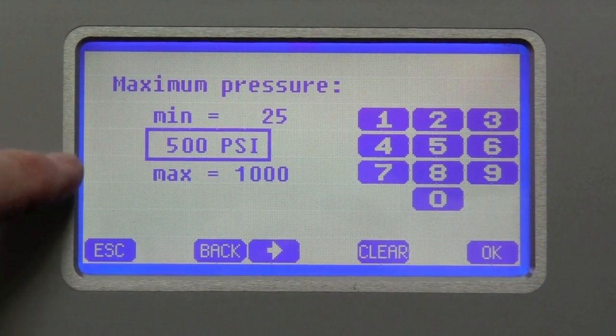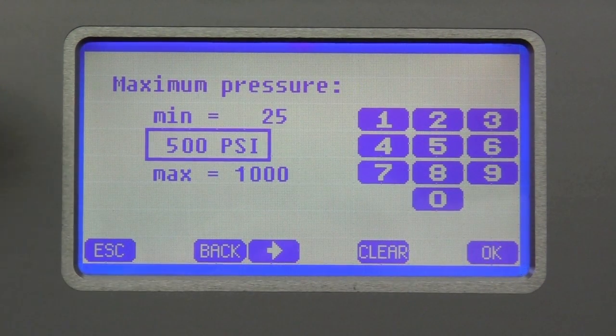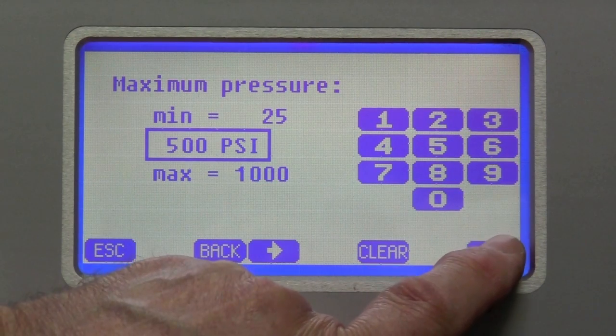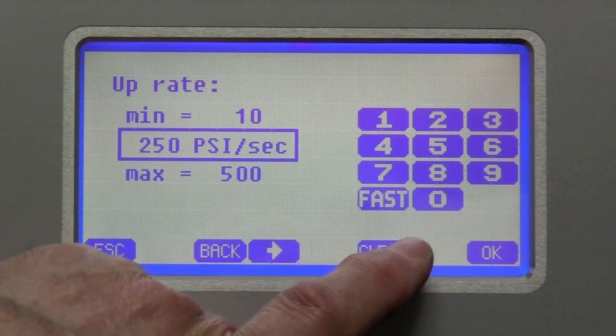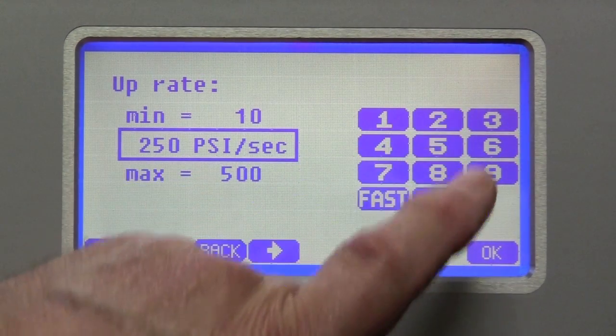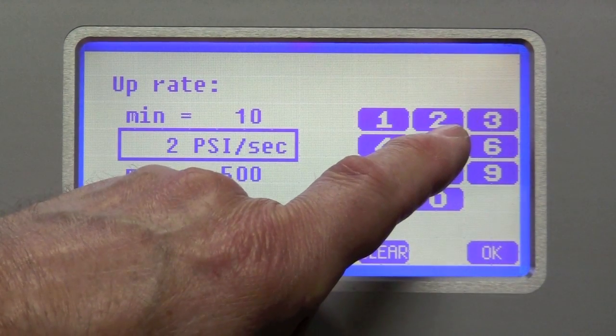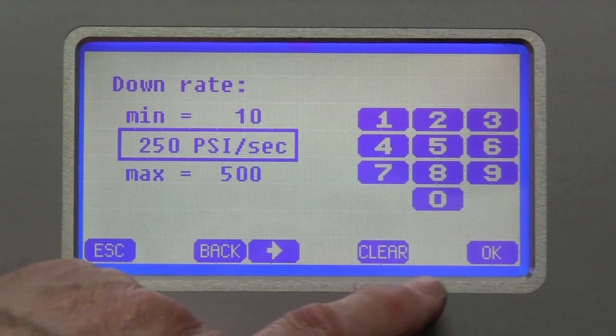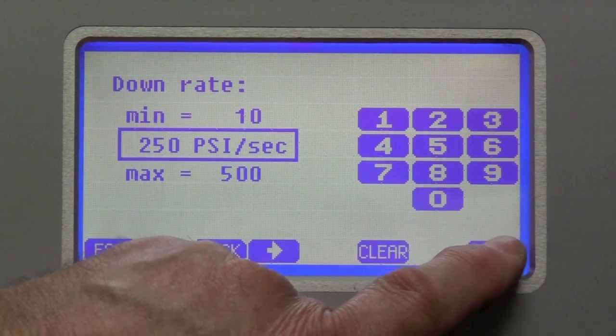And the maximum pressure, in this case, defaults to 500. We'll simply leave it there because I know it's going to leak before then. And the up rate, I'm going to make that 25. And the down rate will leave at 250.